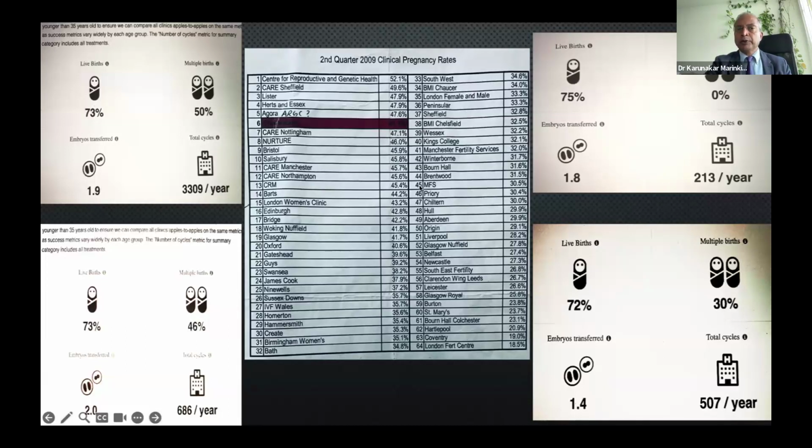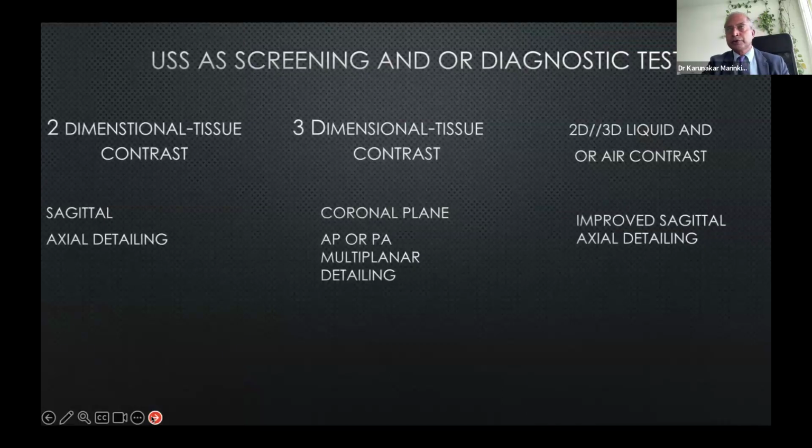Not necessarily euploid embryos, but that is the benchmark you have to set up if you want to call yourself a first-class service provider. Within that, I will see how diligently you can use ultrasound, because ultrasound is your entrance. It's almost like a receptionist. If the receptionist misbehaves, that company's performance, the customer service, will be compromised.